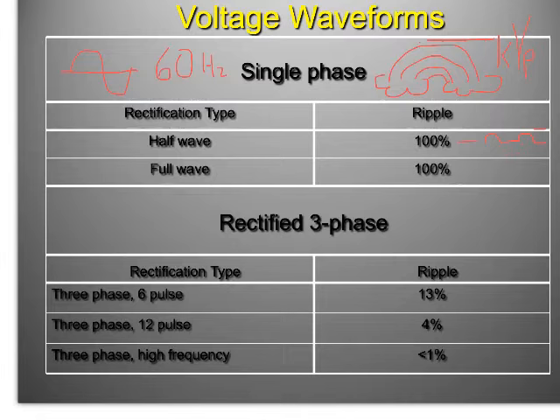It's the top of the kilovolt peak. But there's all these other energies beneath it. We want to minimize those other energies because they're inefficient. I would love it if when I set 100 kVp, every X-ray that exits that tube is 100 kVp, because I could be that much more scientific in my technique, right? So half wave is out.